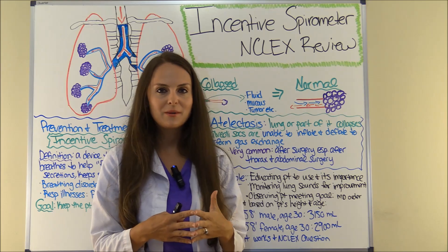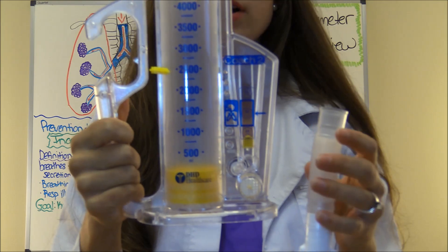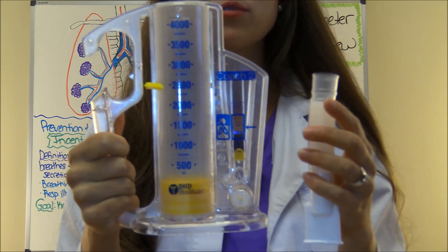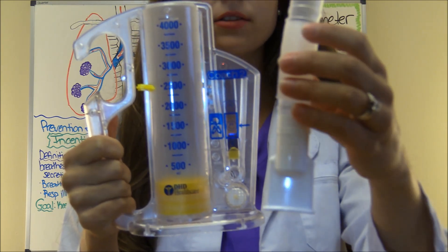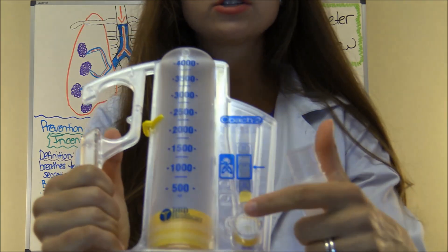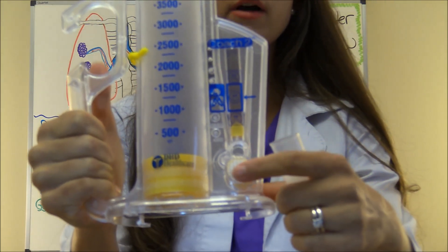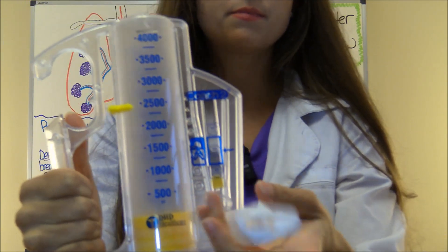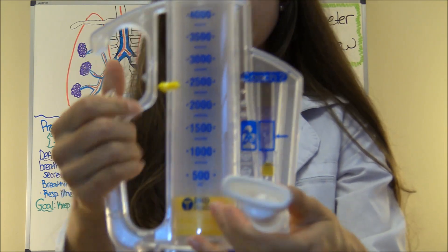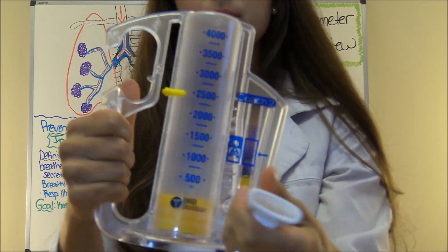Now let me demonstrate how to use an incentive spirometer. Here we have a basic incentive spirometer — every hospital is different but this is the most popular. It comes in a plastic bag with a mouthpiece, flexible tubing, and the device. As the nurse, you connect the mouthpiece tubing to the port and push it on.